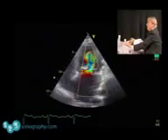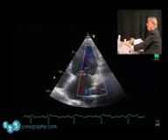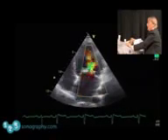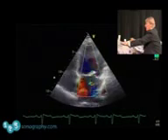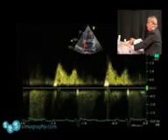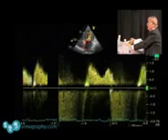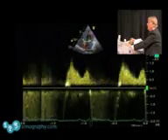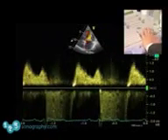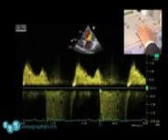Put the color in here and concentrate on mitral valve inflow. So we'll try to get a good candle flame signal here and use that as a guidance to put the continuous wave Doppler through the valve. We'll put the focus point in the valve as well. And here we have the spectrum.